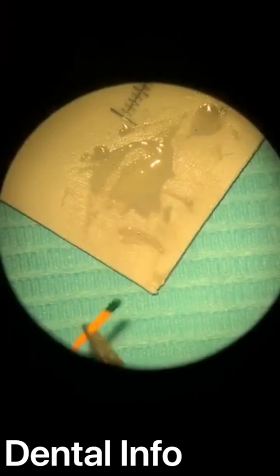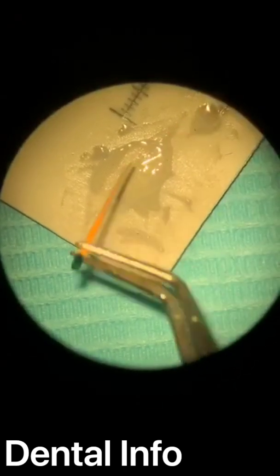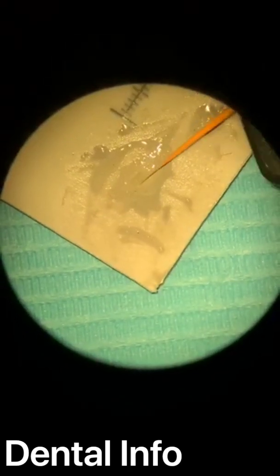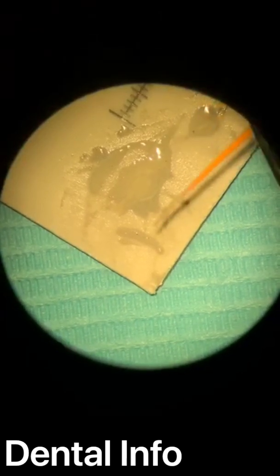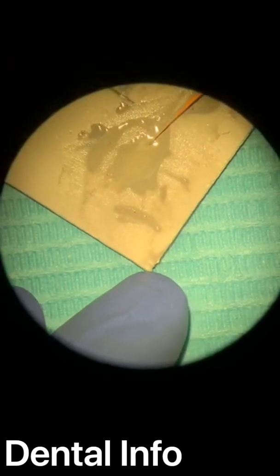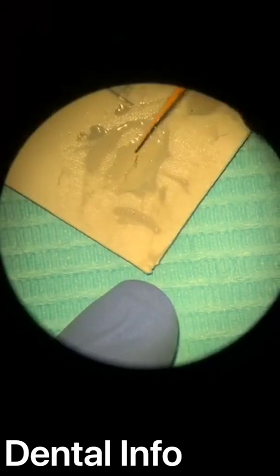So what's the proper way to carry the sealer? I recommend you just dip it like this, from this side and this, just like that, just dipping. Okay, you are dipping your cone. You are not carrying, because if you are carrying the sealer, you will take a lot of amount and you will be messy. The field will be messy. Always when you are working, try to work clean and clear. So do not carry like that. Just dip it like that.